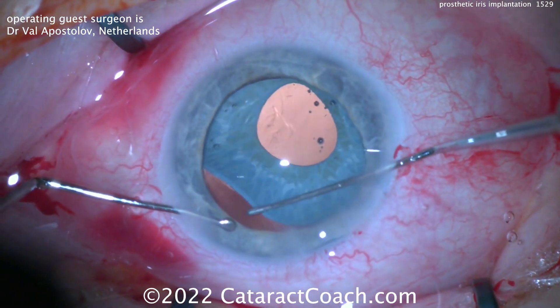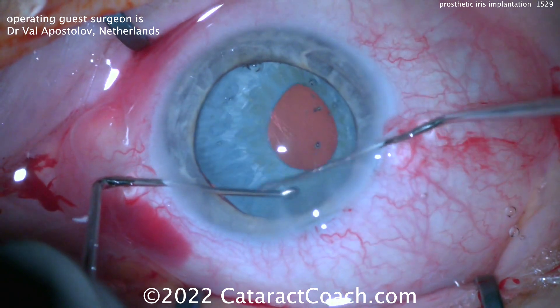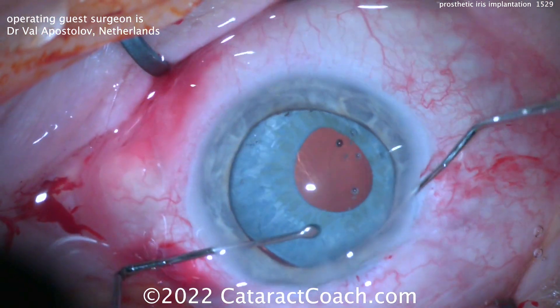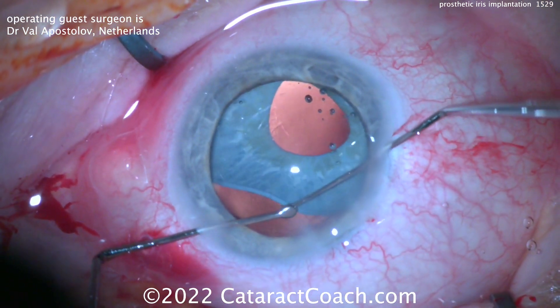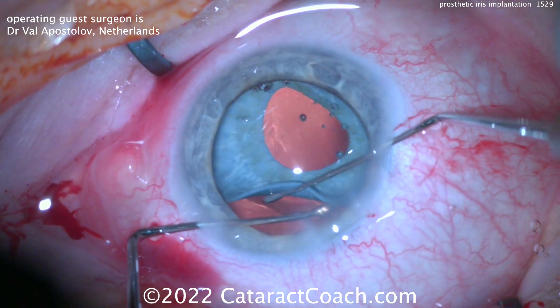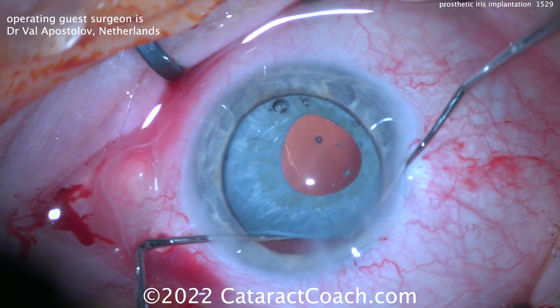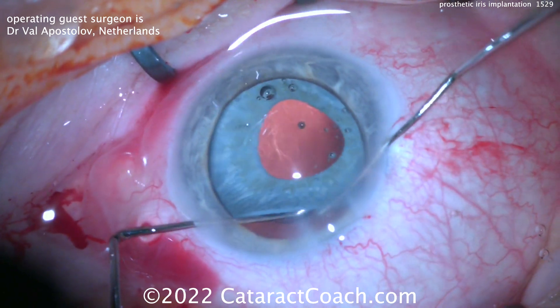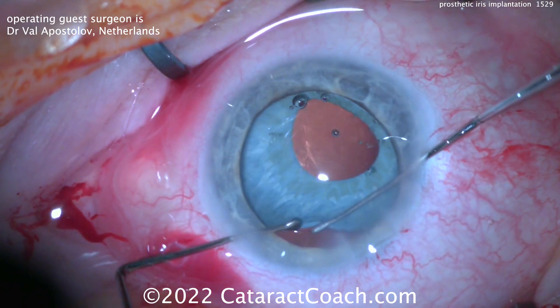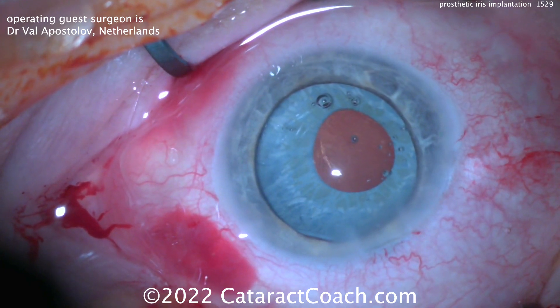Trimming is really not required in most cases. Placing it in the capsular bag — this is the tough part. Perhaps in a case like this you don't need a 5-millimeter rhexis, because the optic is already held in place by this artificial iris. Maybe it would have been easier with a 6.5 or even larger capsulorrhexis. A 6.5 rhexis would make life a lot easier. You don't have to worry about it overlapping the optic, because even a 6.5 rhexis would overlap this prosthetic iris, which in turn has about a 4-millimeter pupil that overlaps the optic.